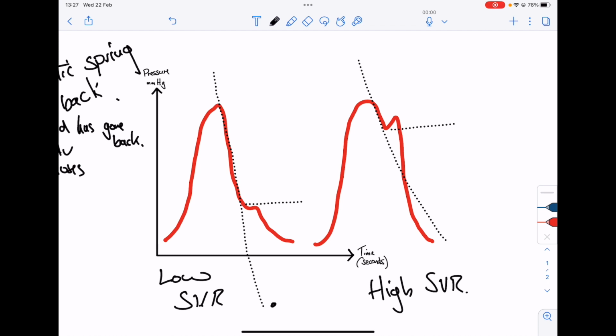Therefore, the pressure wave drops off very rapidly. Remember, this is just a representation of pressure in an artery. The dicrotic notch drops off, and the basis for this isn't 100% clear, but the dicrotic notch is due to pressure waves in the aorta due to its elasticity. Less elasticity means that it's probably going to occur at a lower pressure. Wouldn't quote me hard on that.